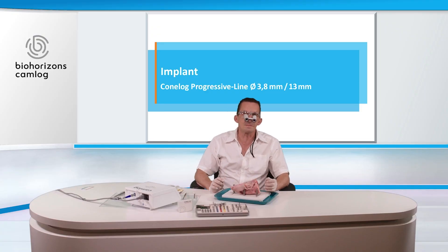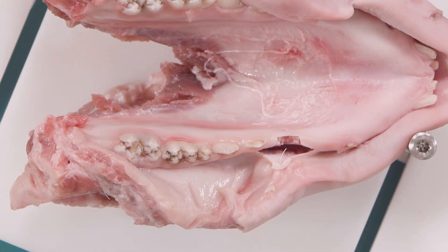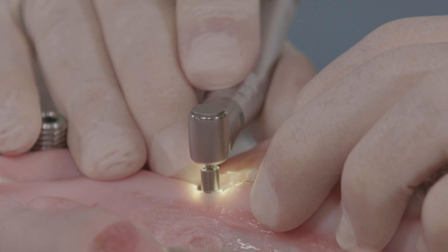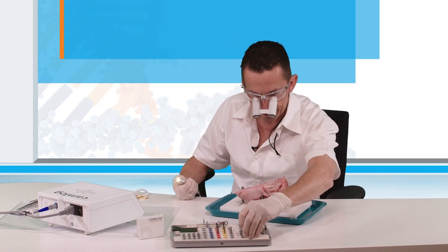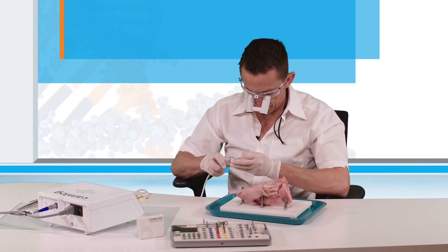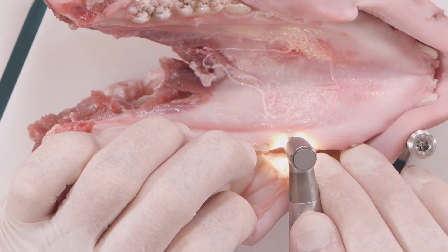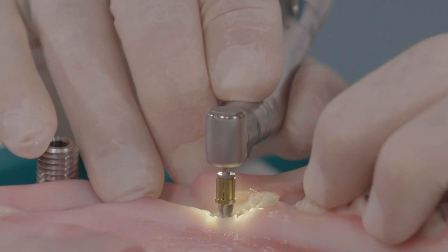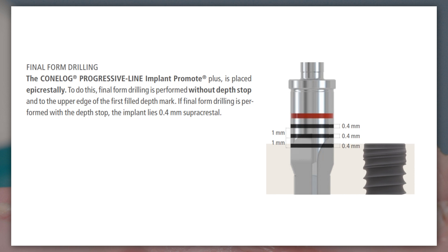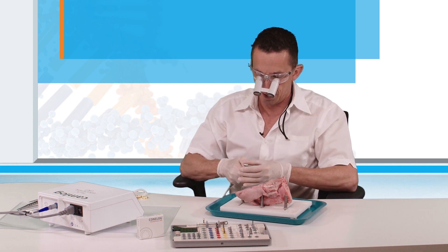Now we are going to place the implant. First the pilot drill. We can control the implant axis with a parallel pin. The next one is the 3.3 millimeter form drill, and the final 3.8 millimeter form drill. If the bone is very hard, you may use the dense bone drill.